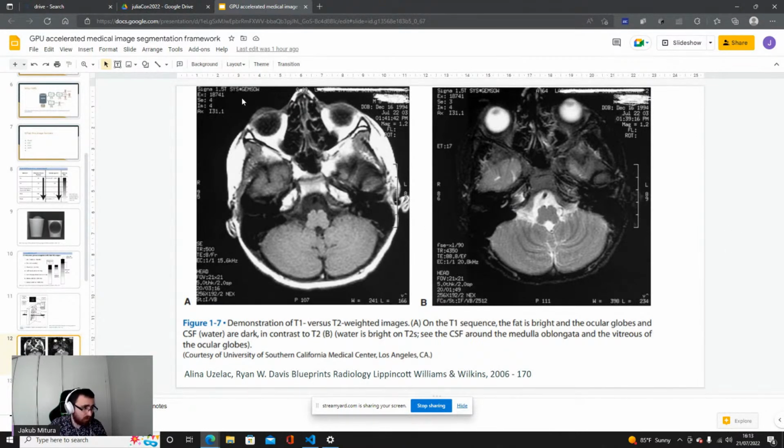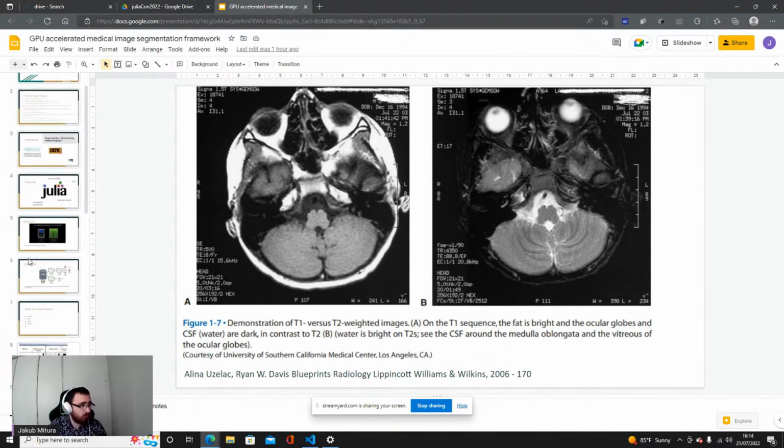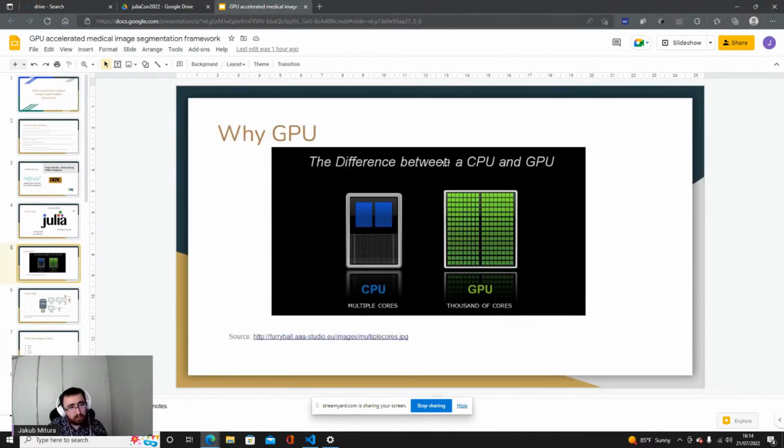So it can be billions of points, yes, because, for example, it can be 1024 by 1024 by, for example, 1000. So it can easily achieve billions of points for one image, and there may be multiple images per patient. In most cases it's not as big as I described, but it can be huge. When you have a huge amount of data, we can get a lot from parallelization.